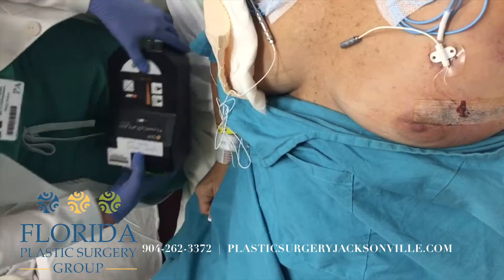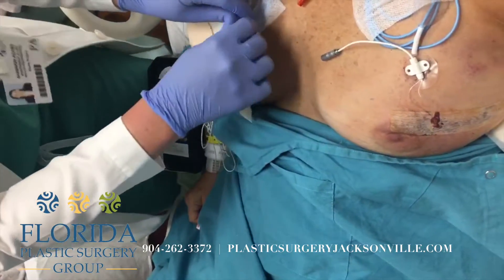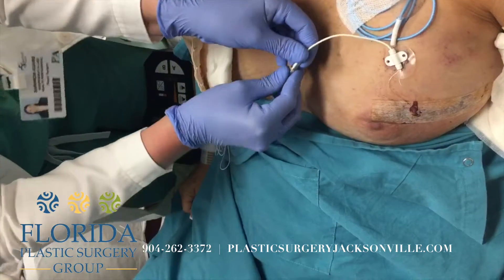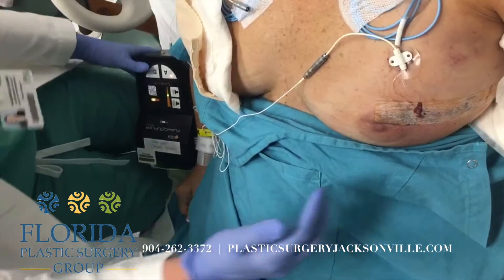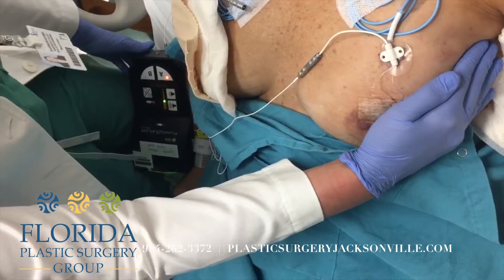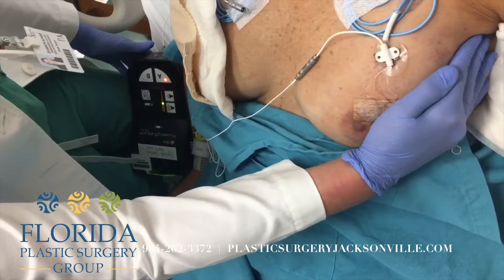As long as the sound is present, the vein is working. If you don't hear anything at all, you should be worried. If you hear a lot of static, you can turn it on and move the breast to the side to pick up a different sound.